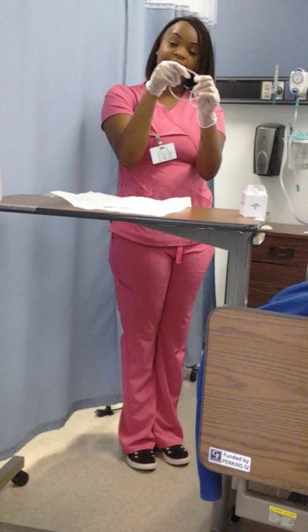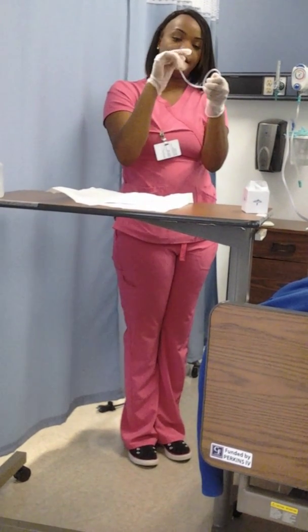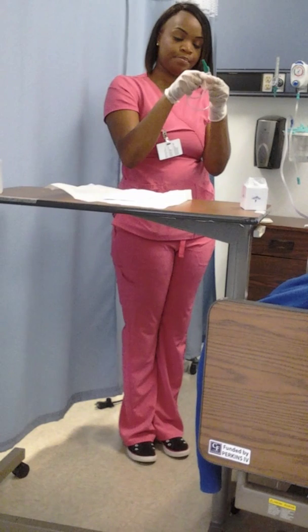My dominant hand is my right hand, so this will be my sterile hand. So I'm just going to take the equipment and try to coil it, best of my ability.